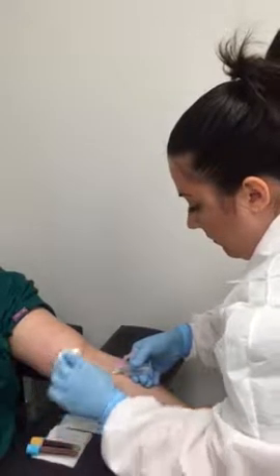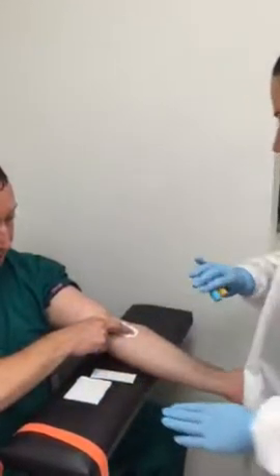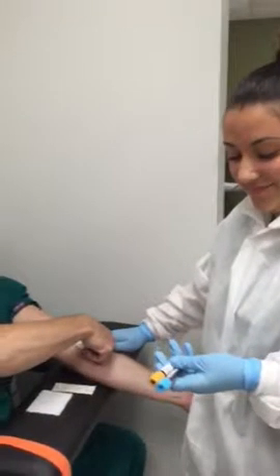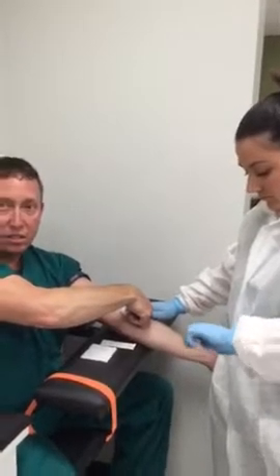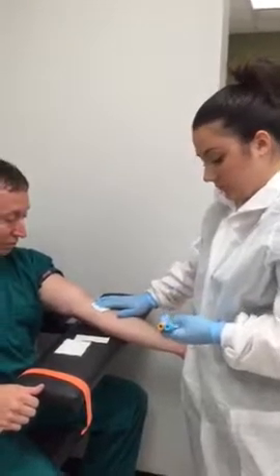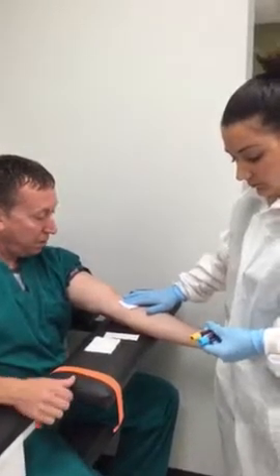Now she's going to get her 2x2 ready, and as she pulls out, she'll immediately use the safety cap and apply pressure. It's important to remember that when it's not a fellow phlebotomy student in the chair, you will have to hold pressure for a good period of time. If the patient is competent, you can ask them to hold it, but you have to make sure they know how hard to press — otherwise it can result in hematoma formation or bruising.